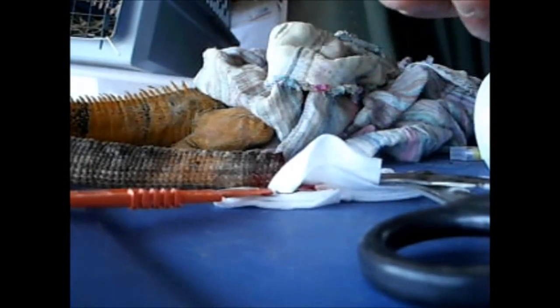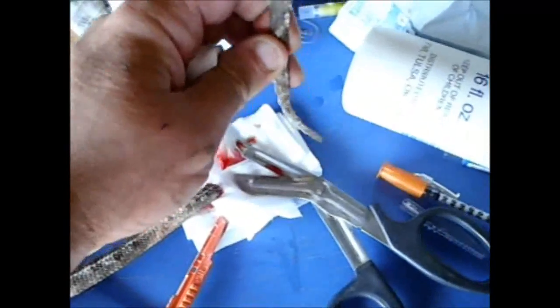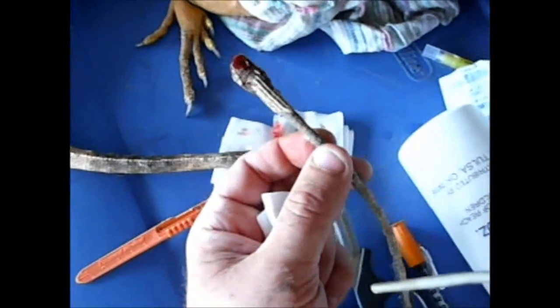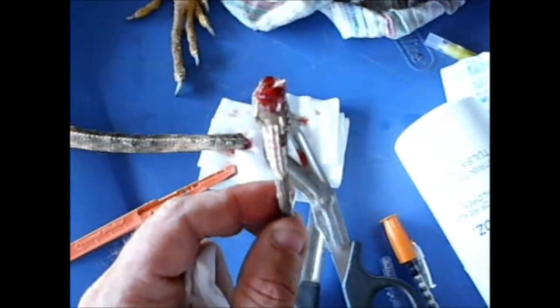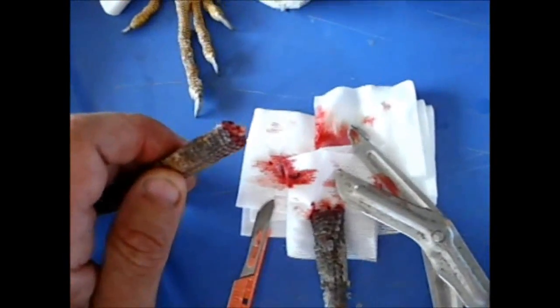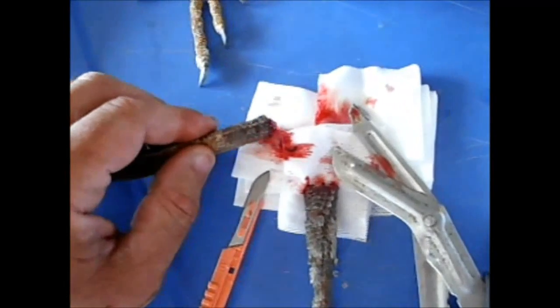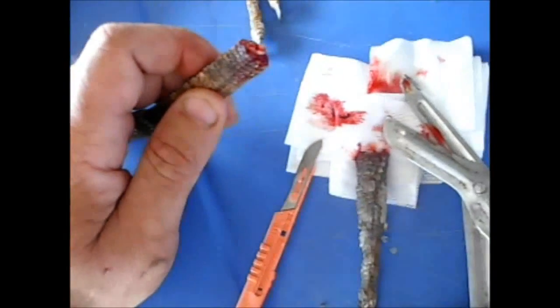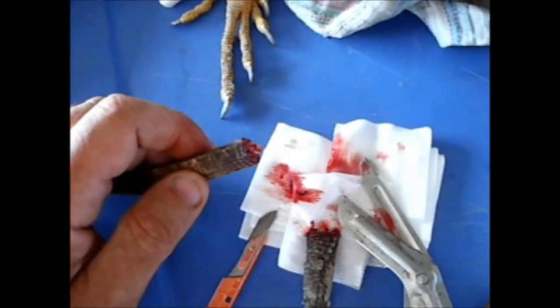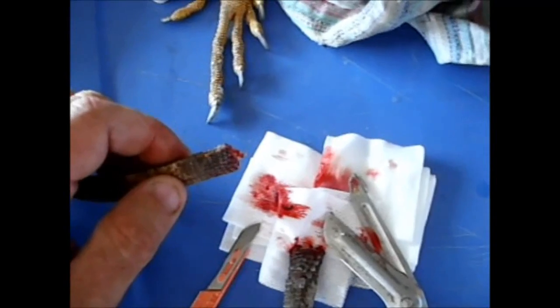And this is our stiff, as you can see. This is just stiff as a board, dead tail, and there's no good that can come from leaving that on. I'm going to clean this up, give him a little more anesthetic here in the tail, and dress that, and then we will allow that to granulate on its own without suturing it. And that'll start filling back in like any other lizard, like an anole. Their tail regenerates. That'll start to grow back in as cartilage before long.